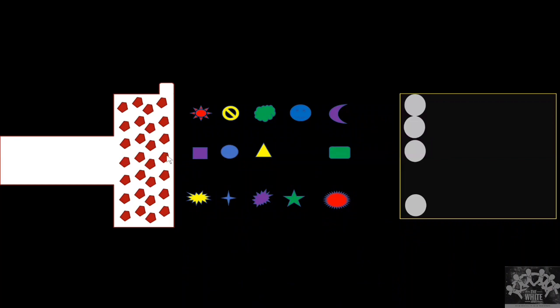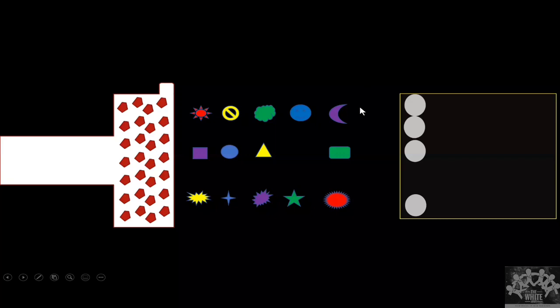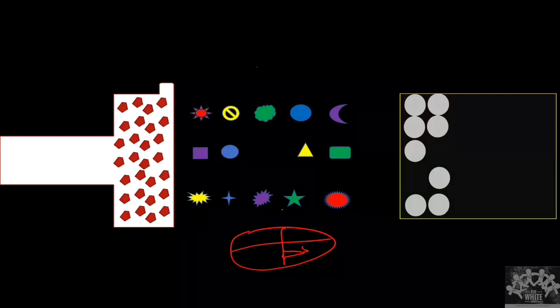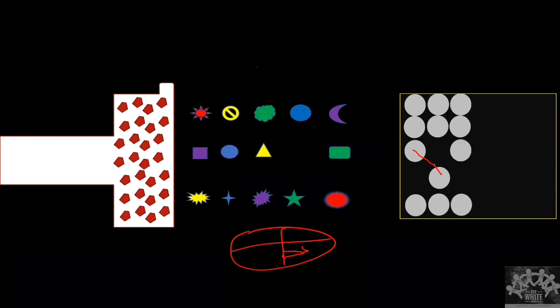Now what happens is after some time the mitral valve moves. The mitral valve goes up and down. If this is the heart and this is our mitral valve, the mitral valve will go down, then come up. Now I form the second image, where the mitral valve has moved down. Again, what will happen? The mitral valve moves up. I'll send one more image, and now the mitral valve has moved up.